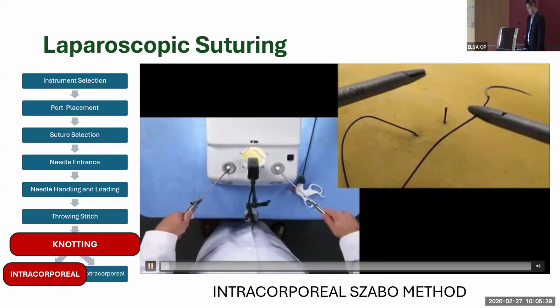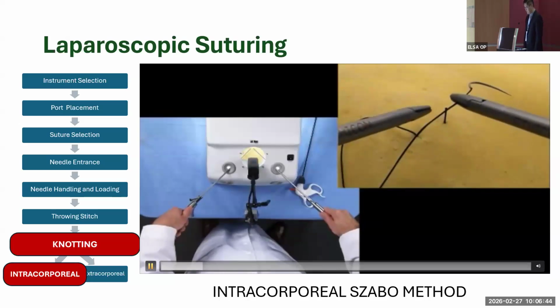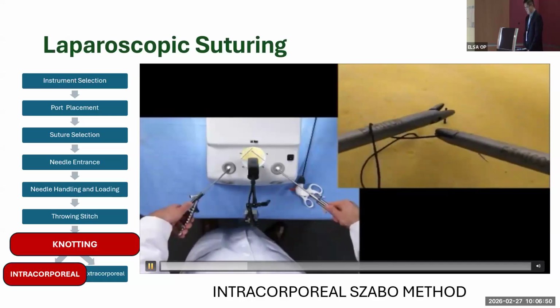We now have the needle to the right of the right-hand needle driver. The suture is coming back at us. The left-hand needle driver is on top of the suture. We rotate the right hand externally. That creates a camel hump. We go over the right-hand needle driver.